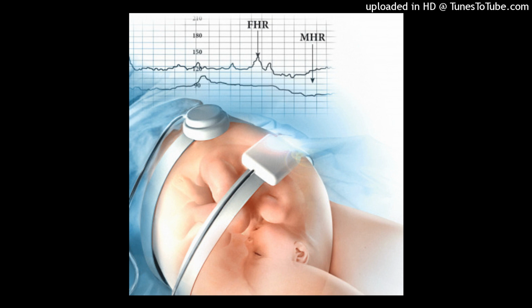Variable decelerations. Variable decelerations may be either periodic or episodic patterns. These decelerations are visually apparent, abrupt decreases from onset to nadir of a deceleration. The onset of the deceleration to the nadir is less than 30 seconds. The decrease is at least 15 bpm below the baseline, with the deceleration lasting at least 15 seconds and no longer than 2 minutes from the onset to the return to baseline.